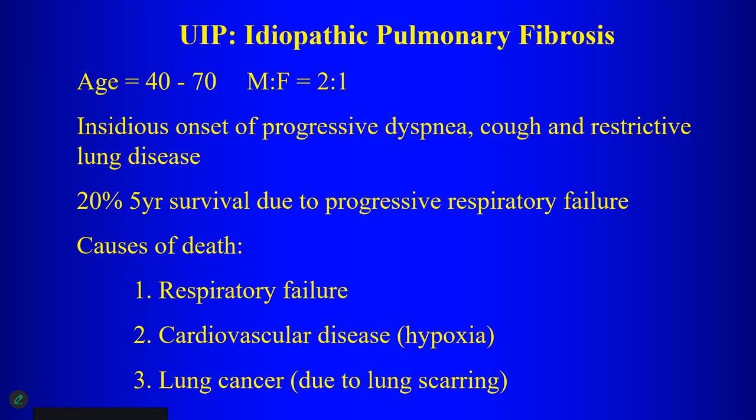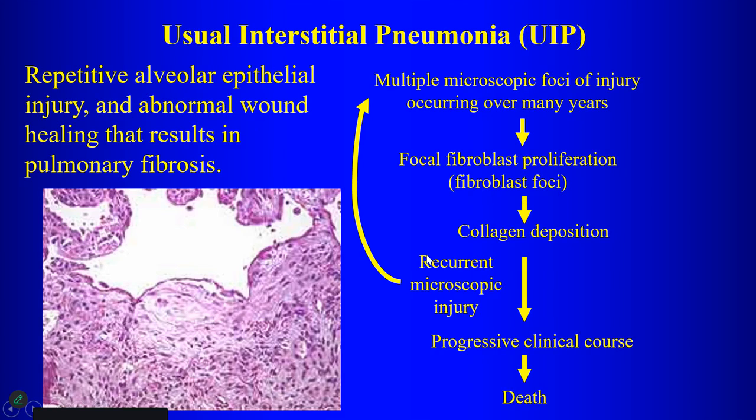So this does place the patient at increased risk for cancer. So you have to have a high index of suspicion when you're reading cases of somebody with significant pulmonary fibrosis, if there are nodules or spiculated lesions, about lung cancer, because they are at increased risk.